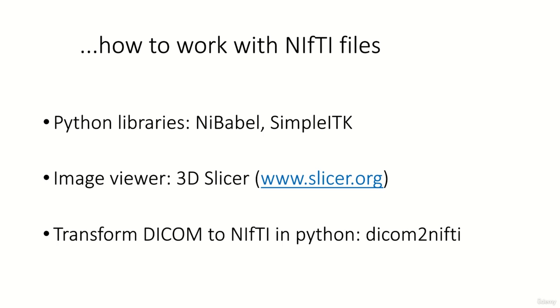Of course, there are also great tools to work with NIfTI files in Python, especially NiBabel, which is built only for this purpose. If you want, you can also use SimpleITK. You can again use 3D Slicer if you simply want to inspect a NIfTI file. If you want to convert a DICOM file or a volume described by multiple DICOM files, you can use a library called dicom2nifti.